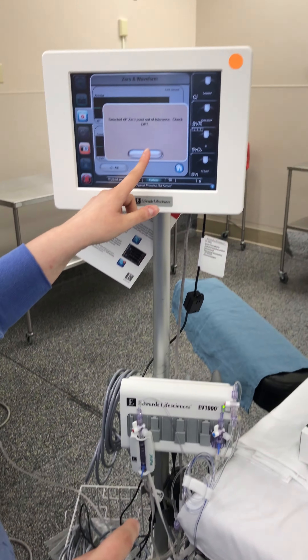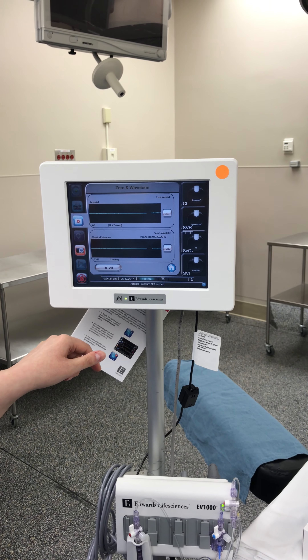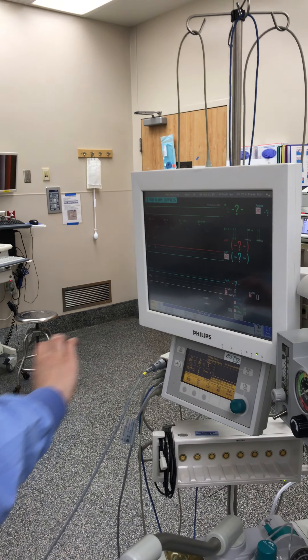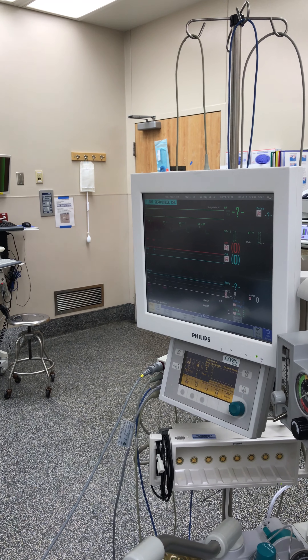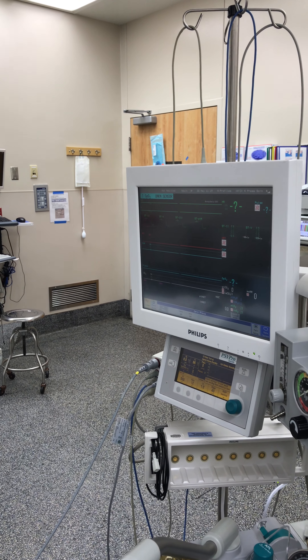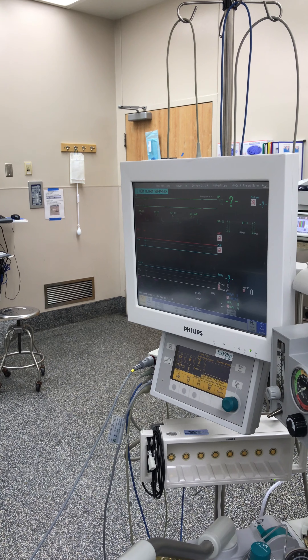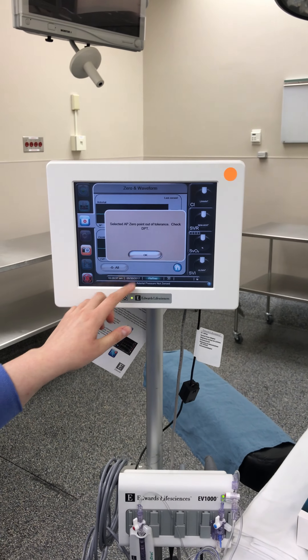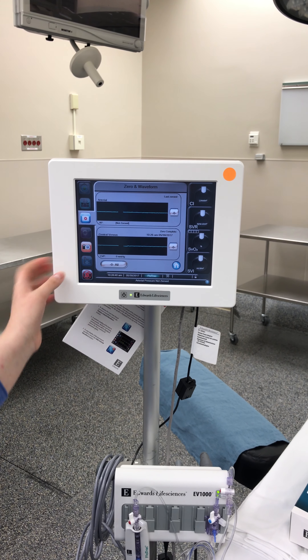It looks like we're going to have to troubleshoot this and do it over again.